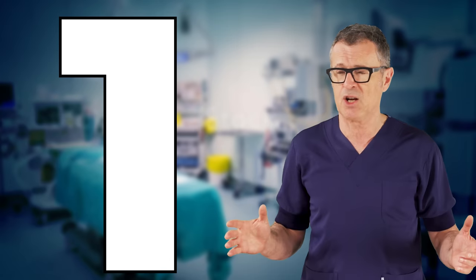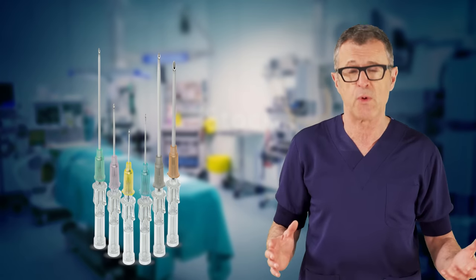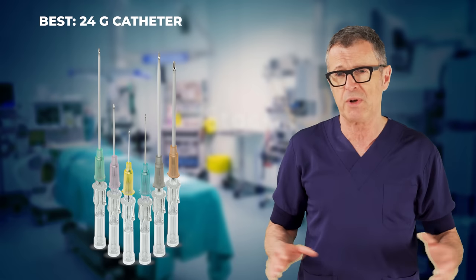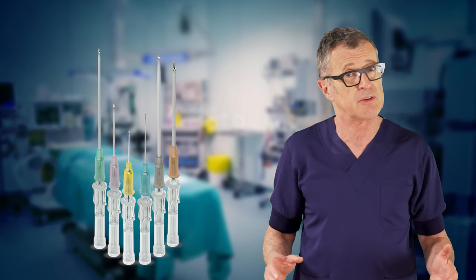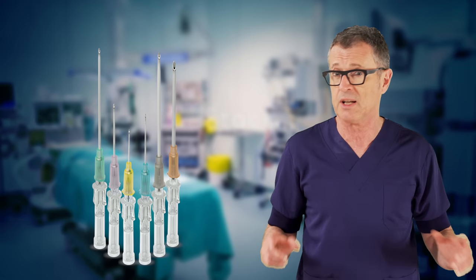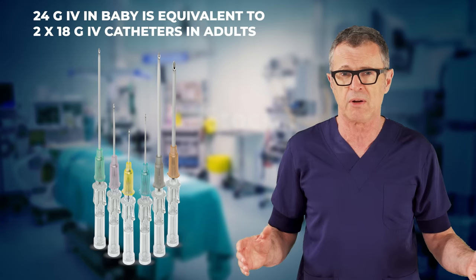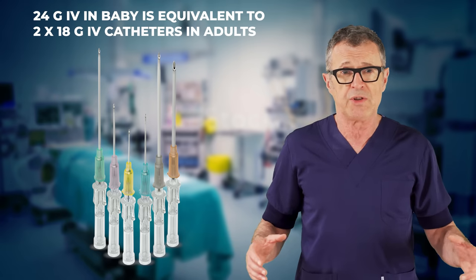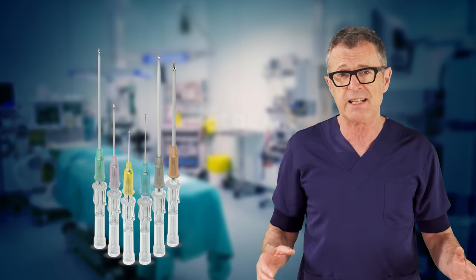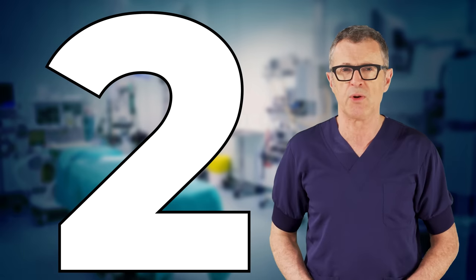Tip number 1: Select the optimal gauge catheter. The best IV catheter size is a short 24 gauge catheter. While I have witnessed others trying larger gauges such as 22 gauge or 20 gauge in little babies, they often fail and the larger gauge is typically not needed. As an example, a 24 gauge IV in a baby of 4 or 5 kg has a free flow rate and bolus capabilities equivalent to 2 × 18 gauge IVs running wide open in an adult.